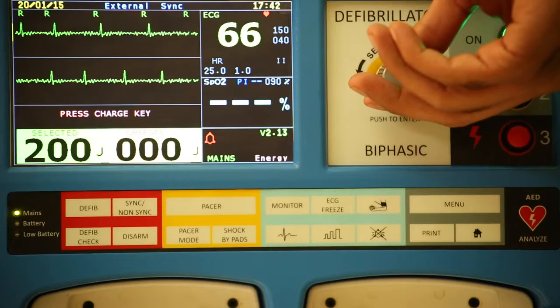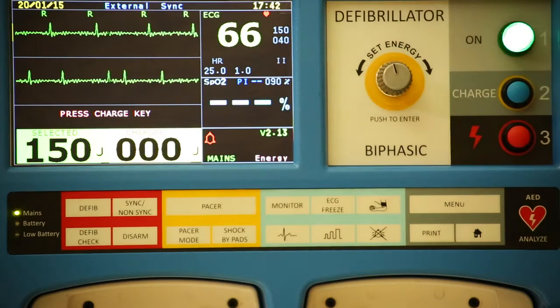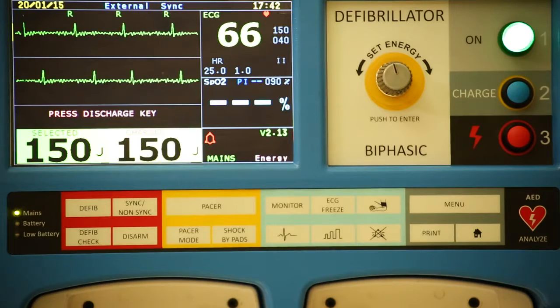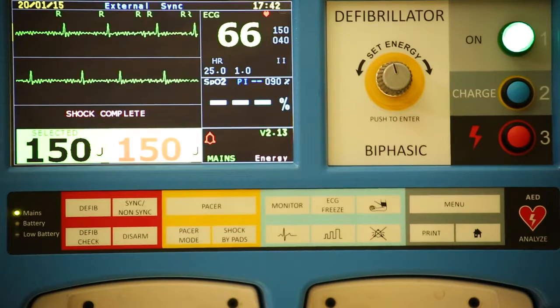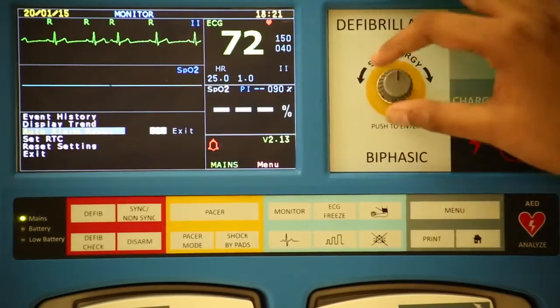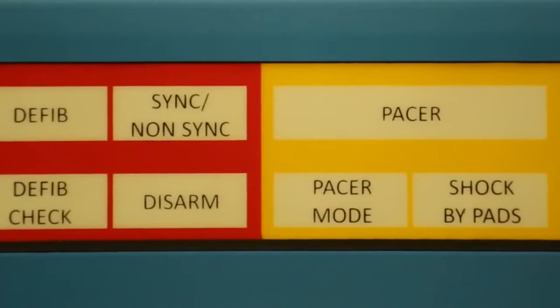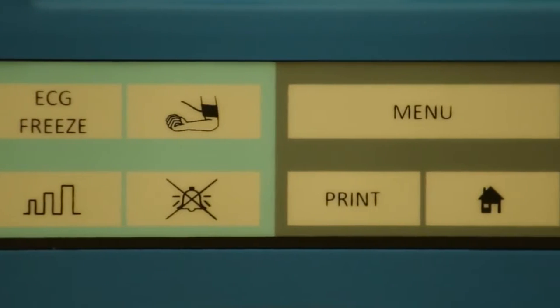The encoder rotates clockwise and anti-clockwise and is used to select the required energy in joules. The charge button charges the capacitors to the required energy in joules. The discharge button discharges the capacitors and delivers the shock to the patient. The encoder can also be used to select and maneuver through different menus. The lower half of the front panel includes a set of buttons that carry out important key operations of the defibrillator.